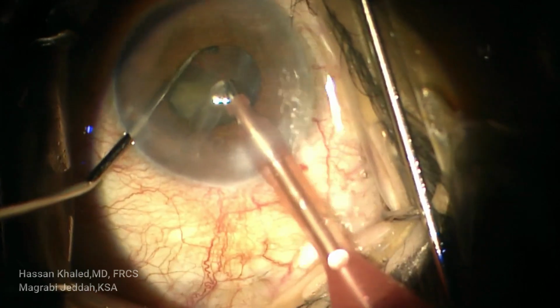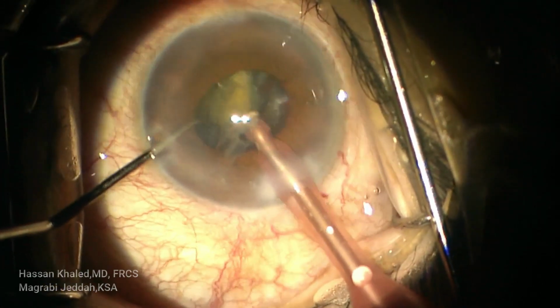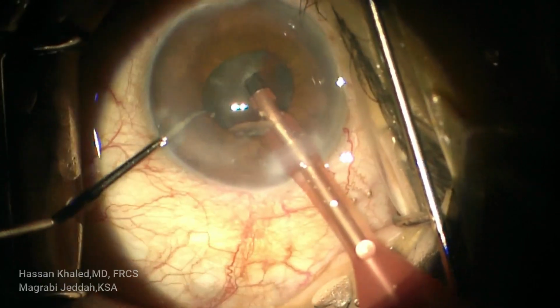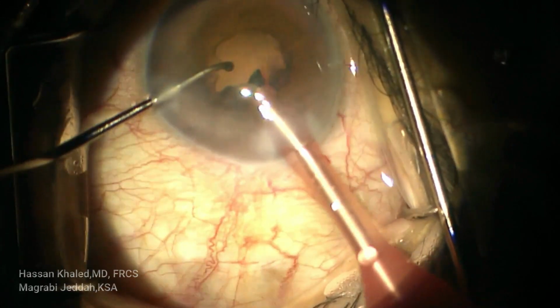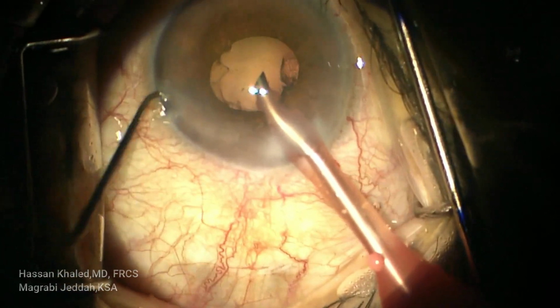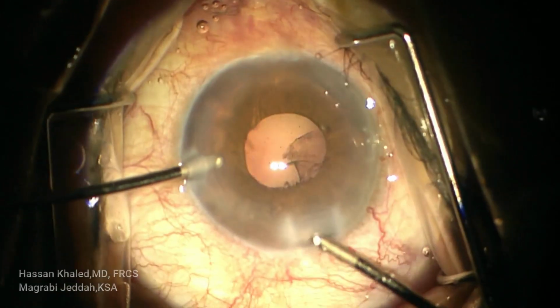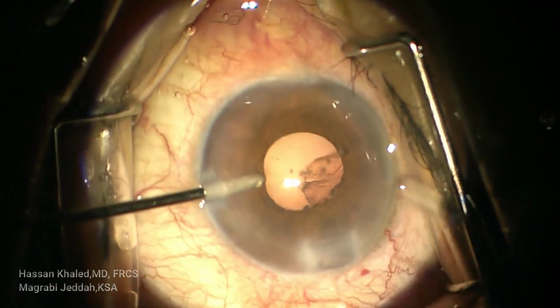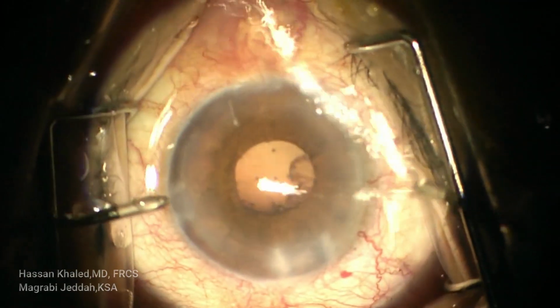You can see now the pupil, it's about 2.5 to 3 millimeters in diameter. Now emulsifying was done perfectly. You can see the pupil now, it's about 2.5 millimeters. Now it's time for cortex removal. Also, this is a very important step.